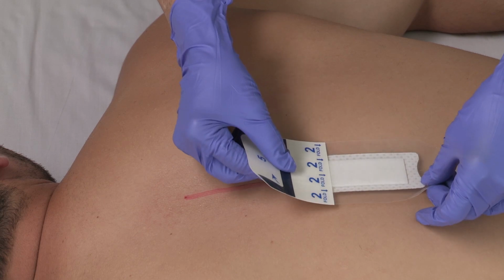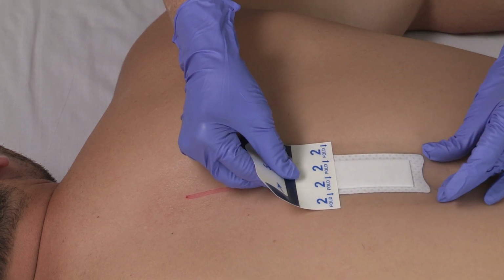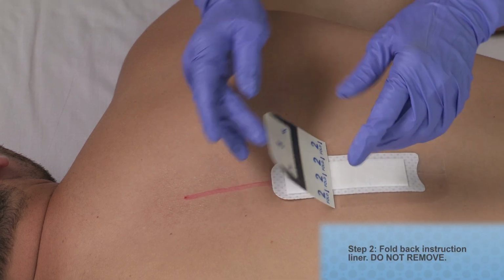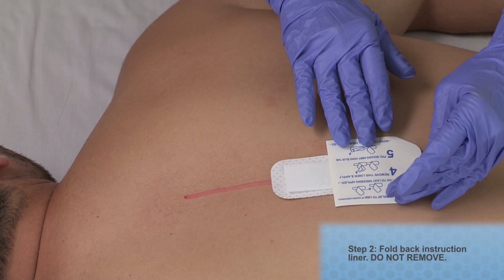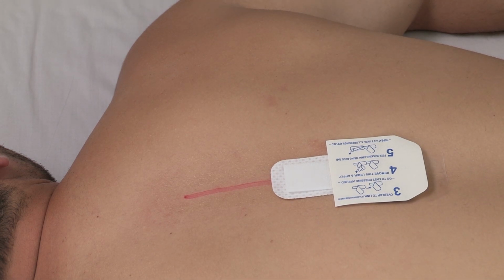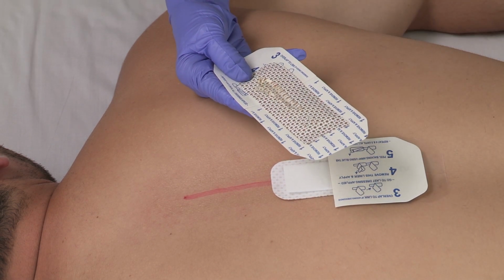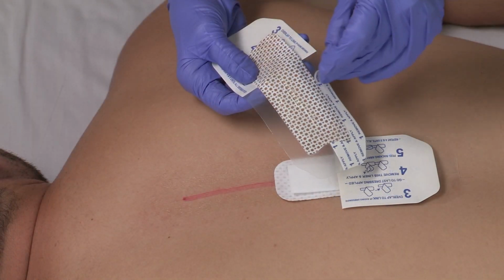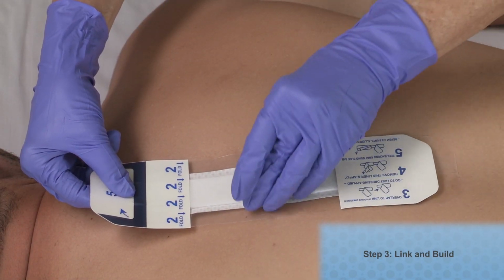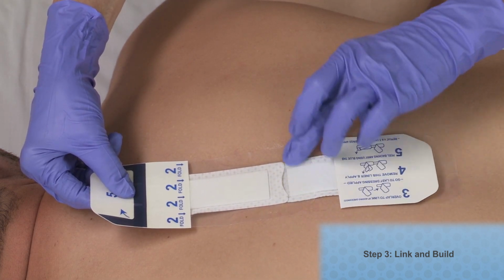Press gently to ensure direct contact of Procellera pad with the wound bed. Next, fold back the instruction liner, but do not remove it. For the next dressing, repeat steps 1 and 2, adding 1 dressing at a time until the full wound or incision is covered. Take care to overlap additional dressings to ensure full seamless coverage.